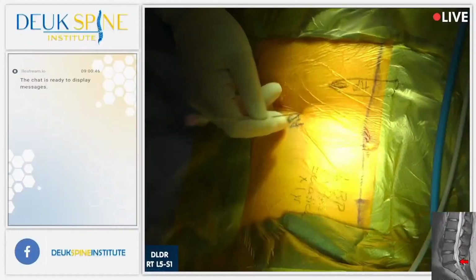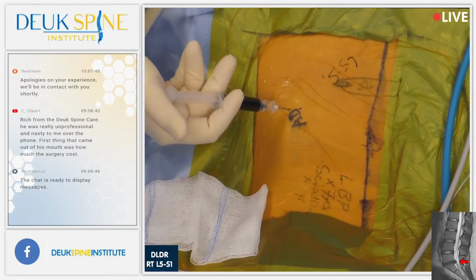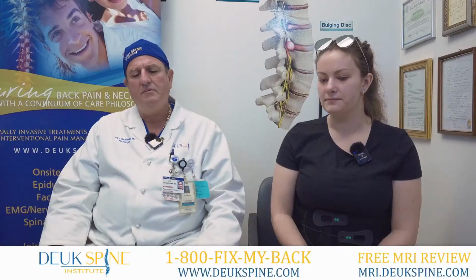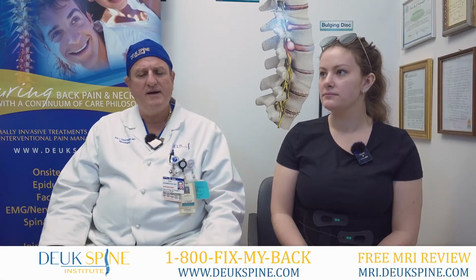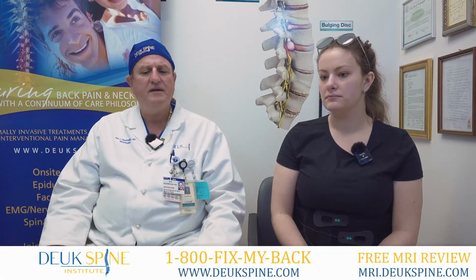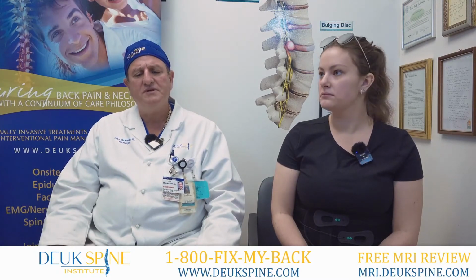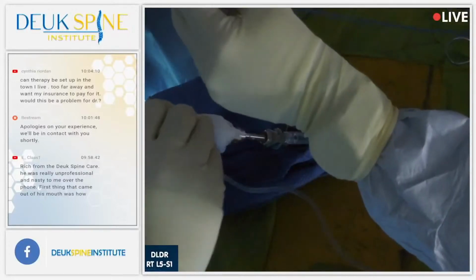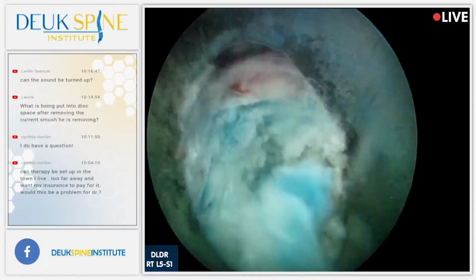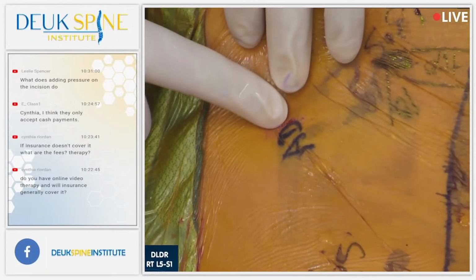So you can see in your surgery right here, we actually tested your L5-S1 disc with a discogram, which is a test done to verify that that disc is indeed causing your back pain. When we tested it and asked you how bad it was, you said 10 out of 10 pain. I asked, is that your typical pain you get every day? And you said, yes, it is. So we verified the source of your pain was the L5-S1, and you can see the laser was used to clean the tear endoscopically. Your incision was only a quarter inch, and there's no need for fusion or metal or artificial discs. This surgery replaces fusion and artificial discs.